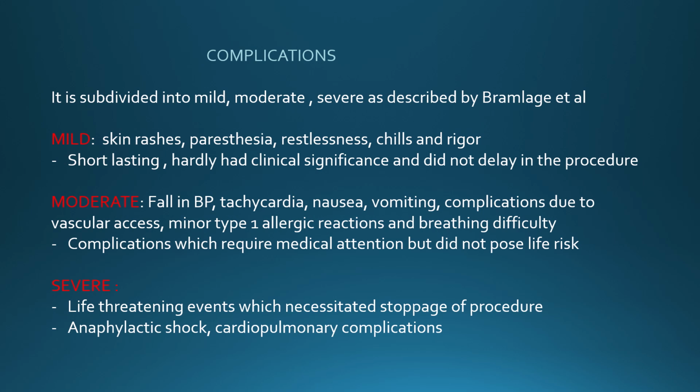Moderate includes a fall in BP, hypotension, tachycardia, nausea, vomiting, complication due to vascular access, a minor type of allergic reaction or breathing difficulty. These complications require medical attention but did not pose any life risk, so they fall under moderate complication. Severe is like anaphylactic shock, cardiopulmonary complication. They are life-threatening events which require stopping the procedure.